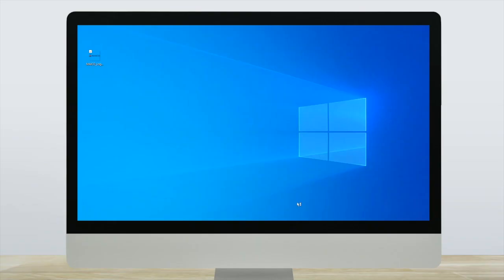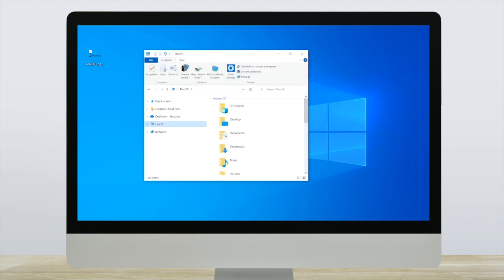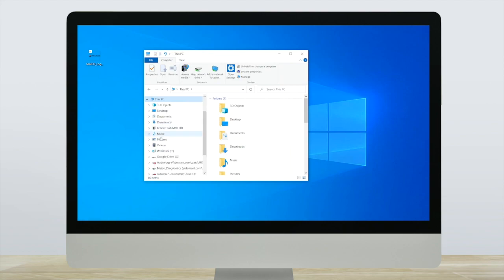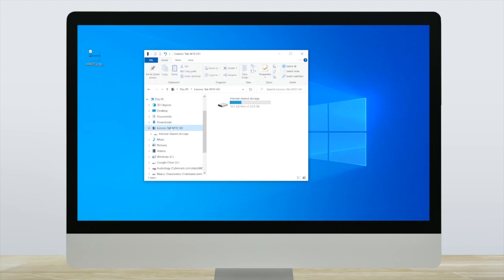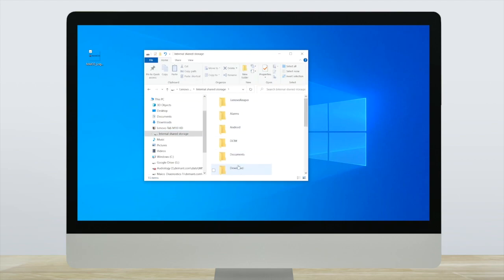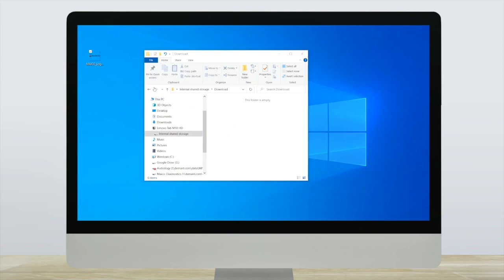Next, from the PC, copy your logo file to the download file of the Lenovo tablet. Go to this PC section and locate the Lenovo tab M10HD. Open the internal shared storage, select the download folder and save the logo here.